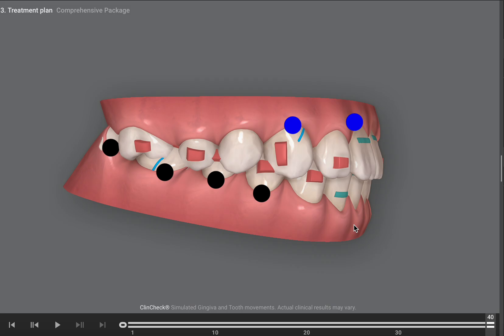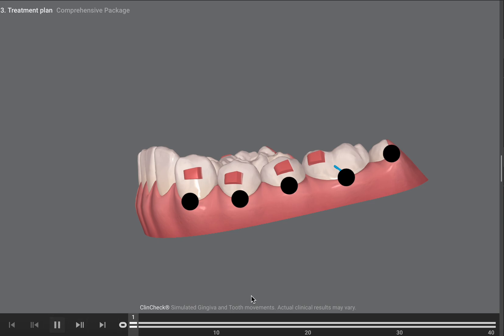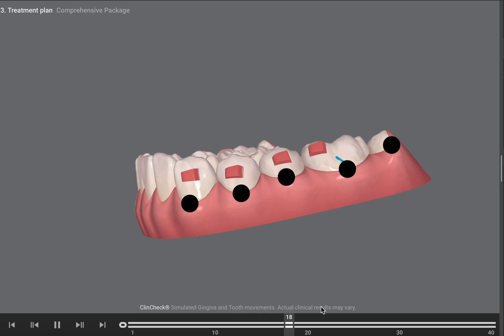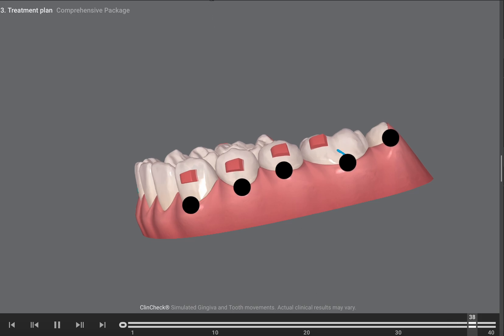Now this is a growing child, so we're doing a lot of leveling of curve of spee. As you see here, we are extruding his posteriors in the lower arch and intruding the anteriors in the lower arch. So there is that leveling of the curve of spee. I'm not a big fan of any optimized attachments; I go for conventional as they work really well.